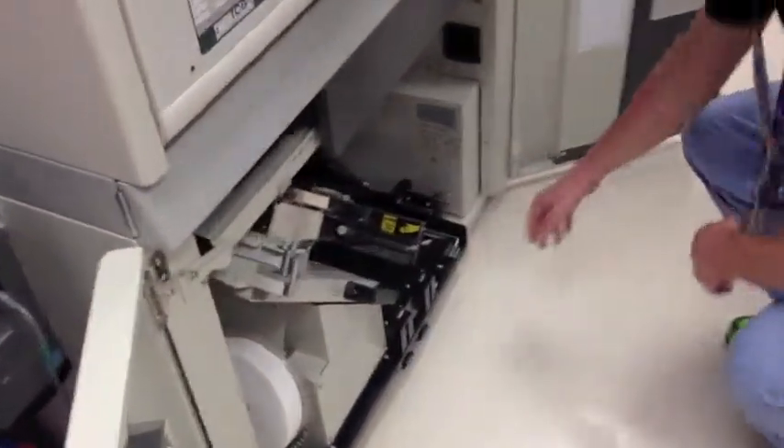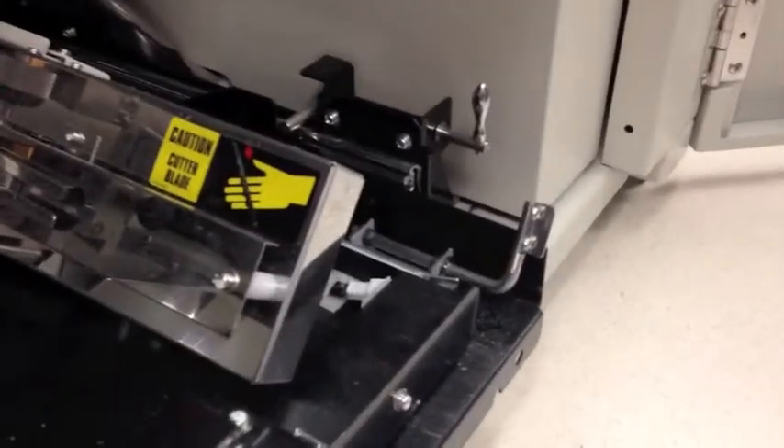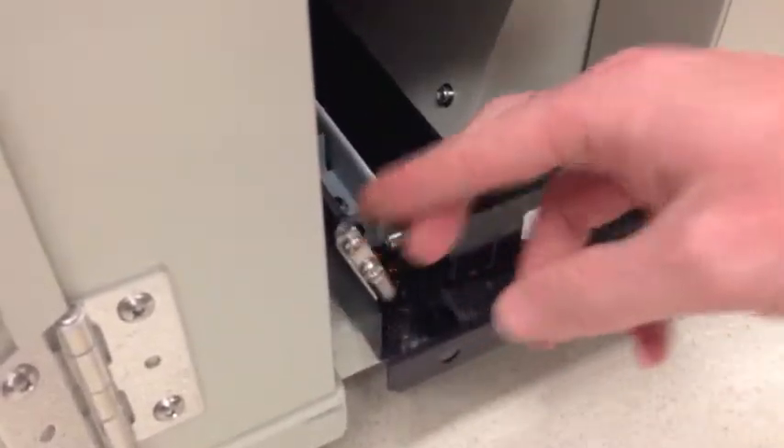Open the lower doors of the packager. Lift the lever at the right and at the left to release the LPU and its trolley.